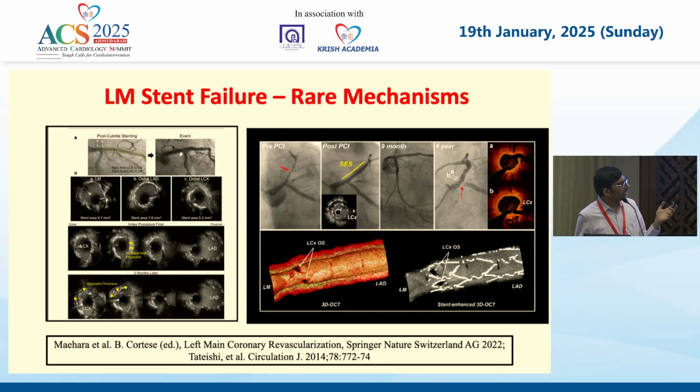And these are the rare causes that I've been discussing. I think the last case we discussed, one is neointimal coverage of your side branch struts. And this is a stent failure that is related to abluminal wiring. When they did a culotte stenting, the wire went behind the stent cells. So this is resulting in your stent restenosis.